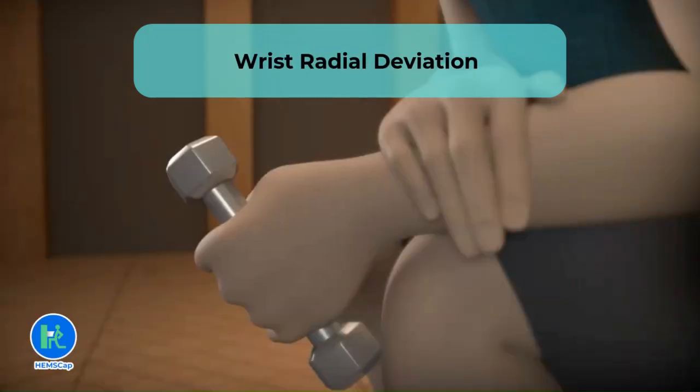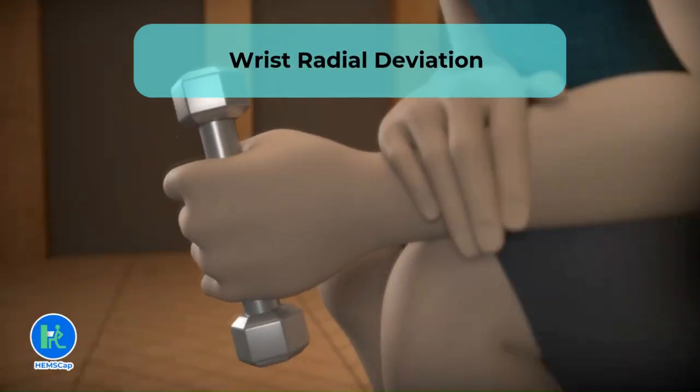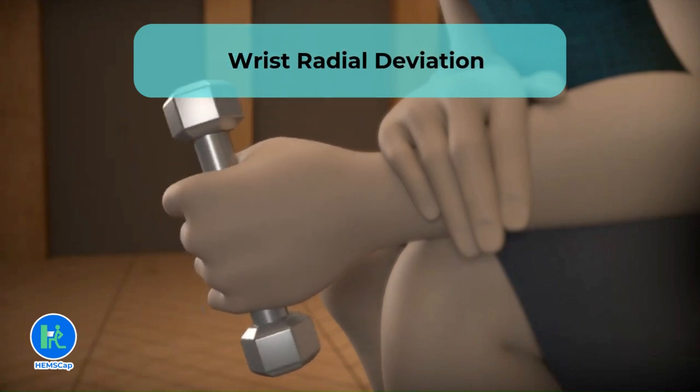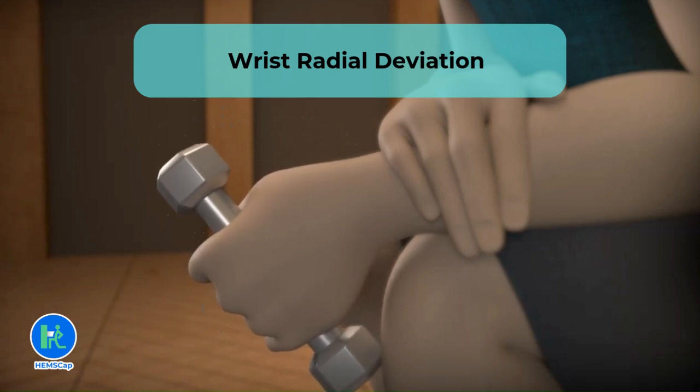By performing wrist radial deviation 3 times, the patient targets the radial deviator muscles while the therapist monitors motion control and functional improvement. Since this movement overlaps with assessments, it is used in the platform both as an exercise and as an assessment.